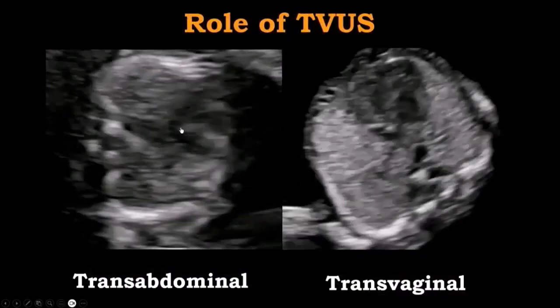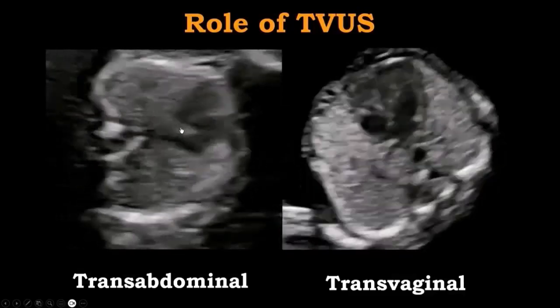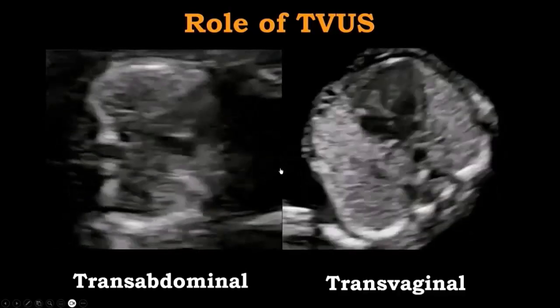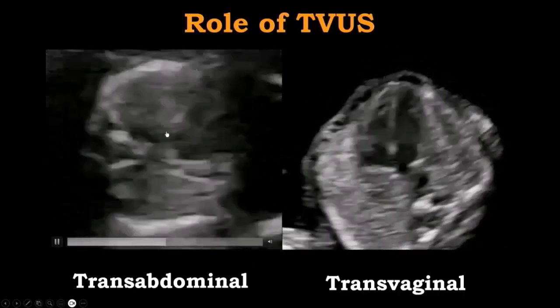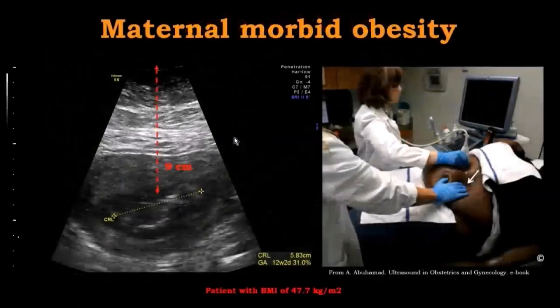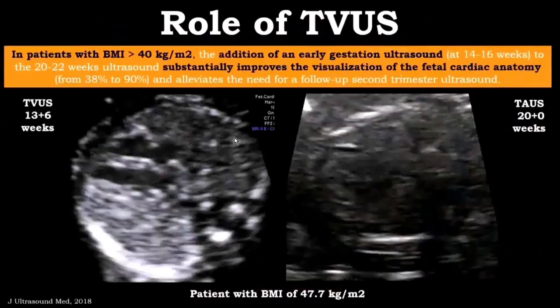I would like to highlight and say a few words about transvaginal versus transabdominal examination. Definitely the transvaginal examination is the rescue technique when you have very insufficient visualization using transabdominal exam. And of course, with difficult patients and difficult abdominal walls, we are struggling, and this is where the transvaginal exam can help.